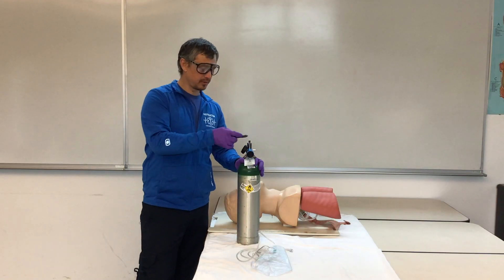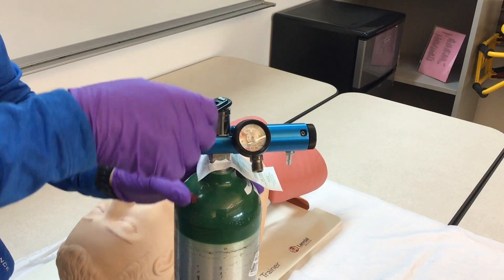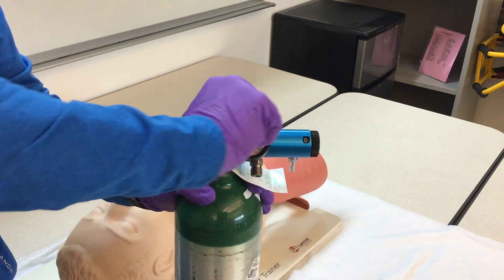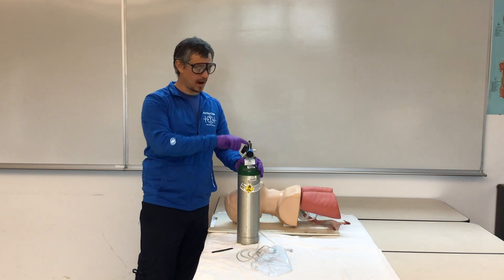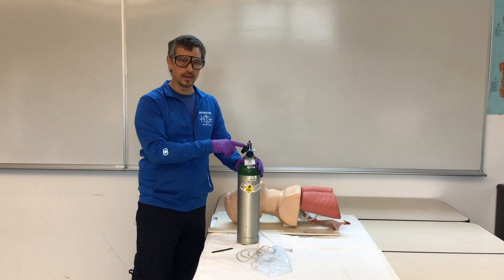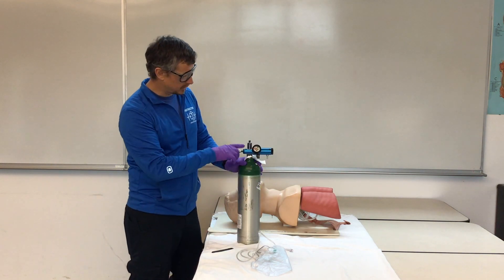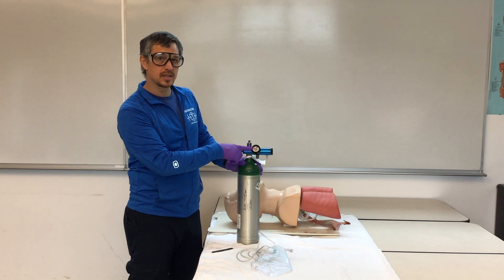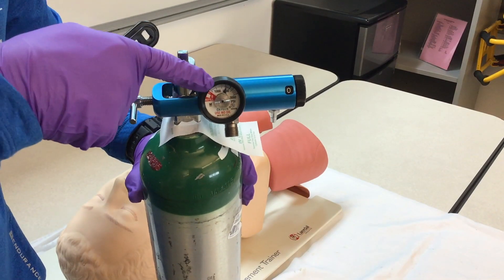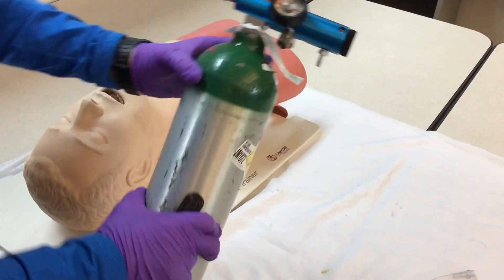With your oxygen wrench, crack your tank. All you need is a quarter of a turn, and you'll listen for leaks. If you hear a leak, it will be obvious, and then you need to figure out if you need it tighter, if you need an O-ring, or where the leak is. After we've listened for leaks, we'll look at our regulator to check our pressure to see that we have oxygen in our tank. We see we have 1,500 pounds here.